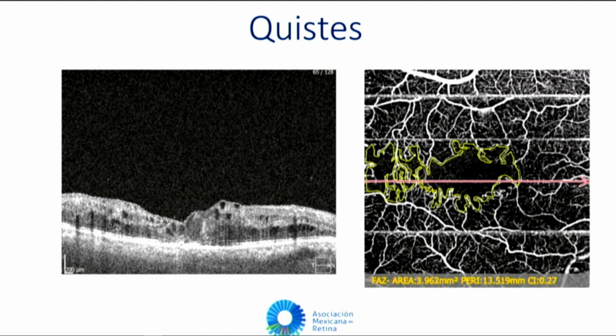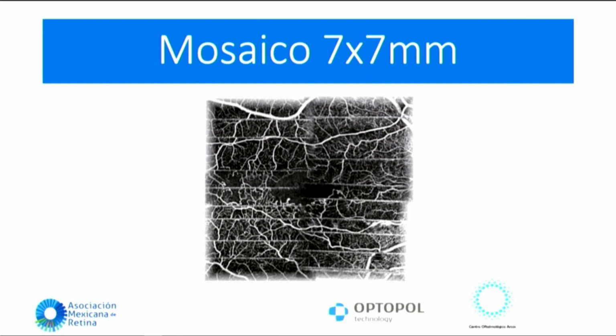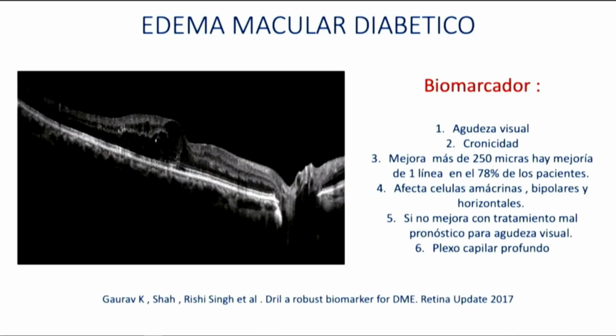And in these examples of large and mid and small cysts, well, this is a patient who had a diabetic macular edema, and when it comes to carrying out an angio-OCT, we see this irregularity on the foveal avascular zone increased. Concentration and extension. We can treat them, but with excellent communication with patients so that they are told that they might not improve because of ischemia and because of the foveal increase. When we increase the mosaic, we see the extension, the capillary closings in this patient.